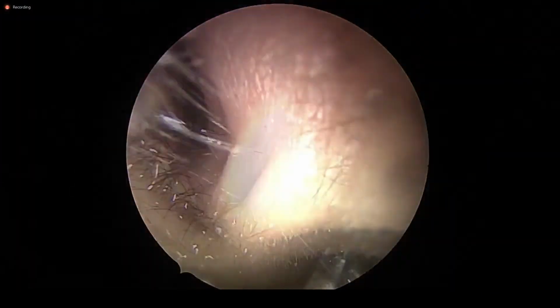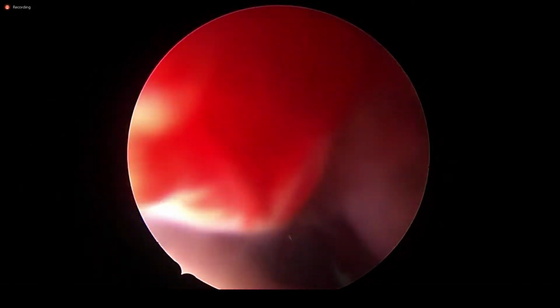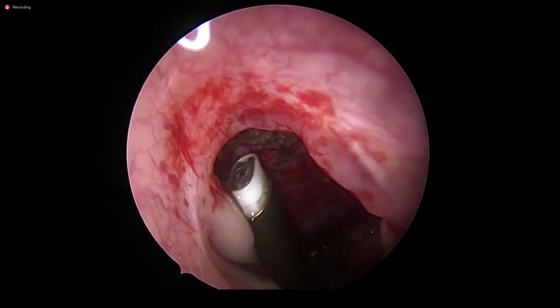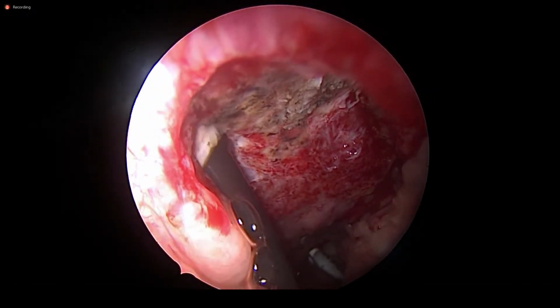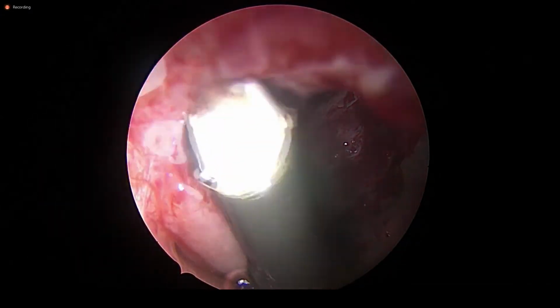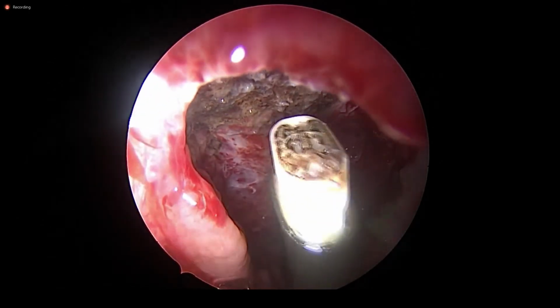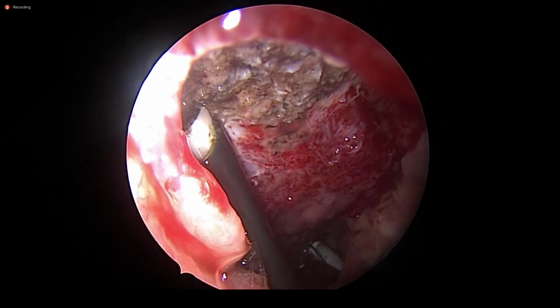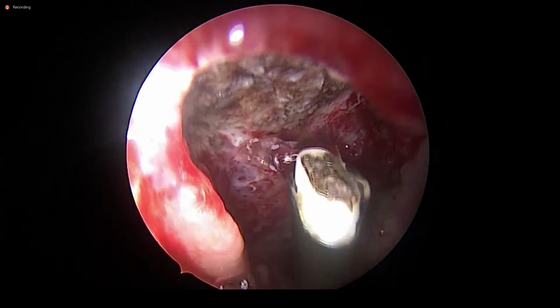There is no question of post-operative bleeding once you do this carpet coagulation of the periosteum layer. Can you see this? Yes, sir. So this is intentional carpet coagulation. There was a question in the beginning about when to use what equipment. Both the coagulator and the microdebrider are good. You should know when to use what.